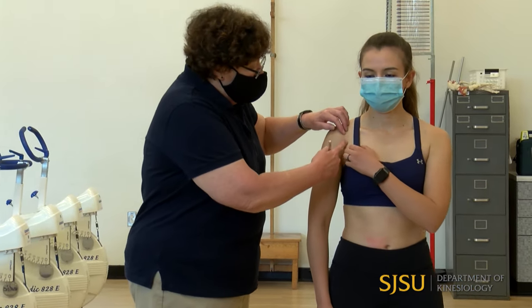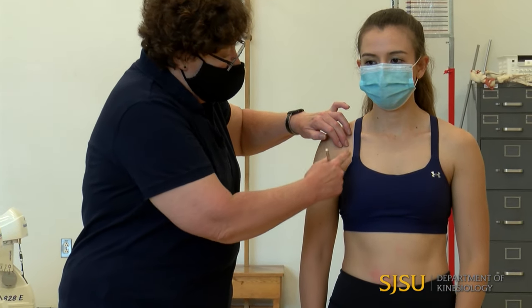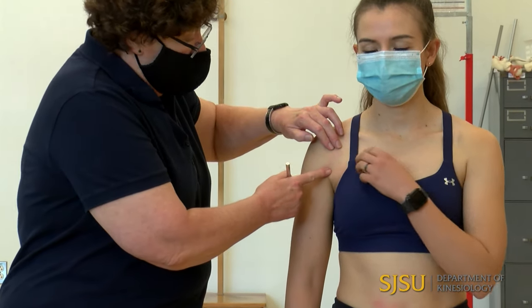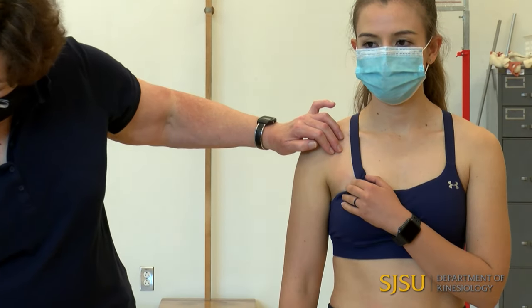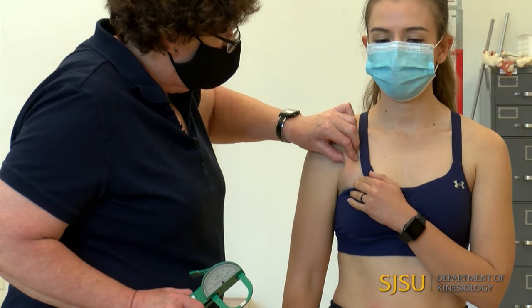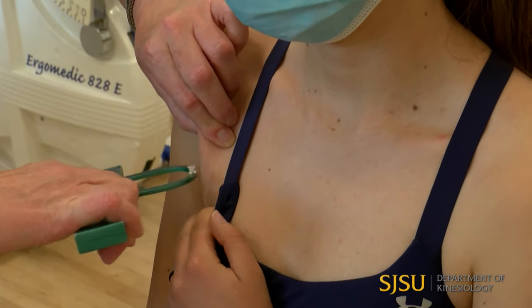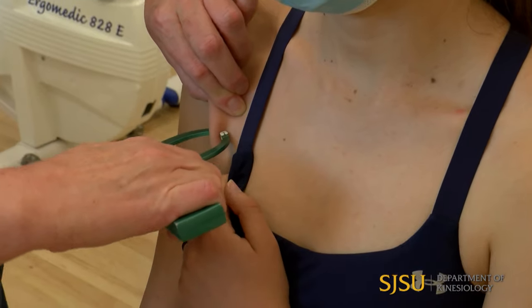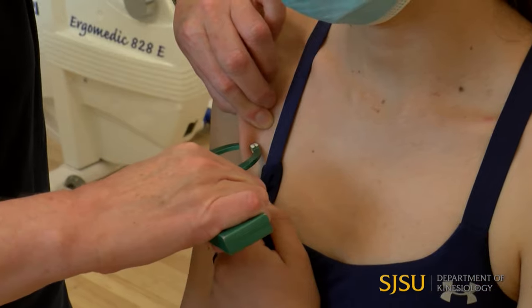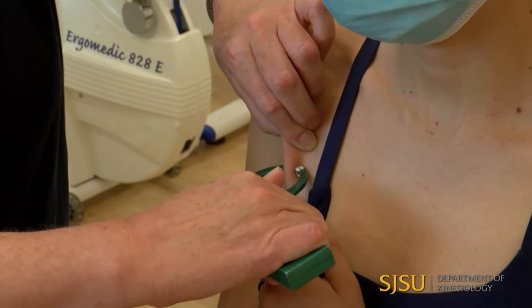We're going to start with the chest measurement. It is done from the anterior axillary line, and typically from that point to the nipple. For the standardized site, we go as high up near the anterior axillary line as possible. I pinch with my thumb and index fingertips — it's a diagonal skinfold, angled slightly down. I always pinch above the site, leaving about a one centimeter gap between my fingers and the caliper tips, then release the caliper jaw and read it about four seconds later.